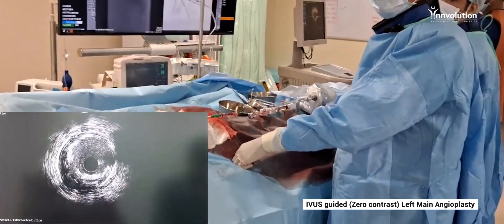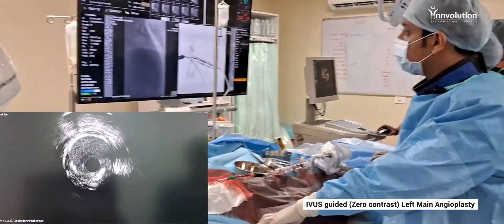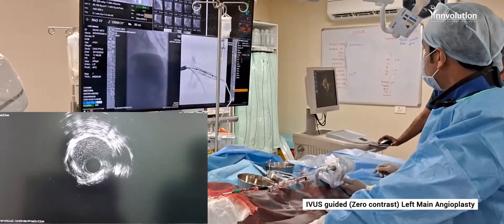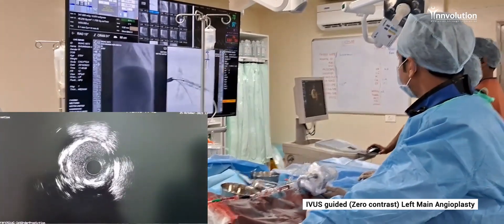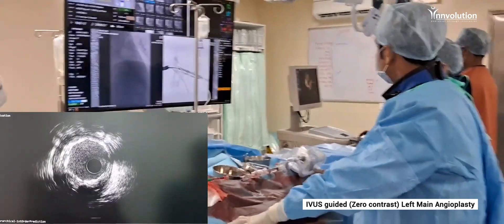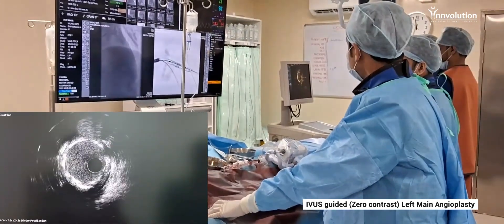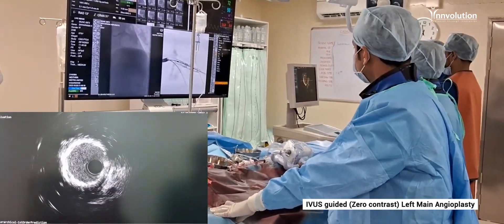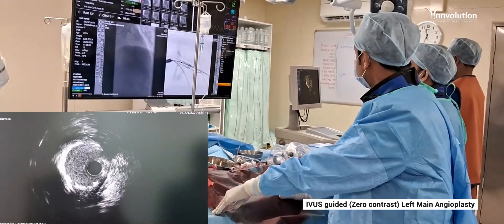The stent is well-opposed — both the distal part and the proximal part. We are seeing the left main. The stent struts are well-opposed, there is no thrombus, and there is no dissection anywhere.